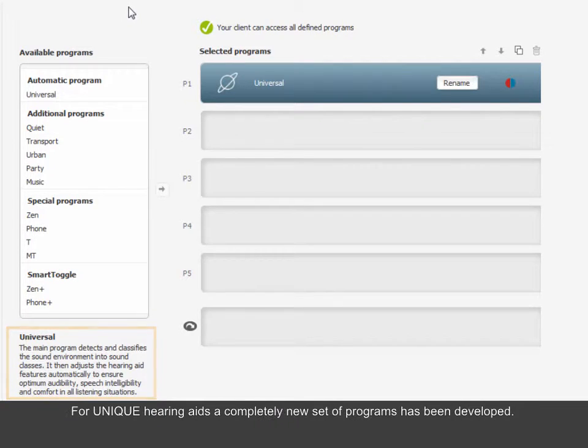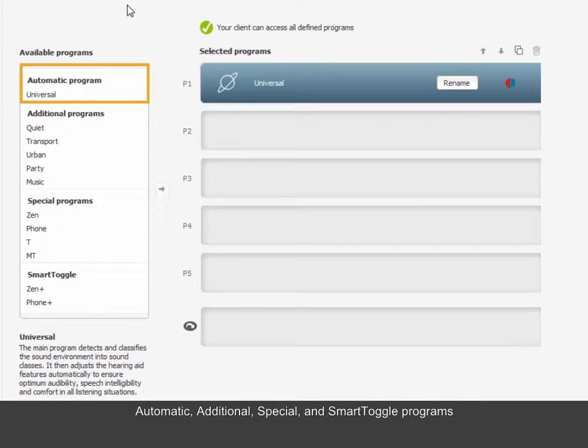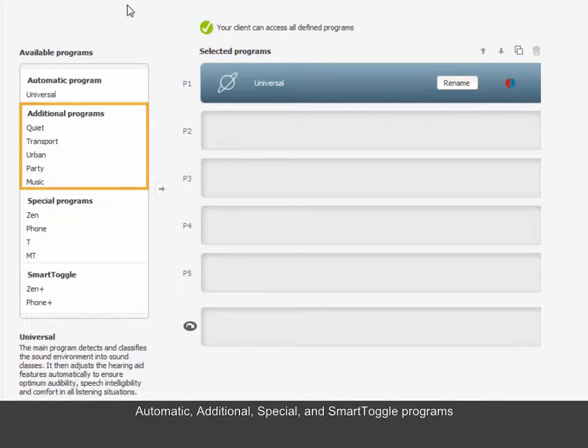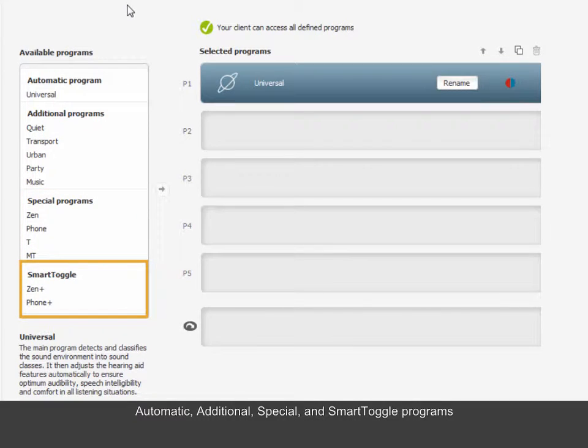For unique hearing aids, a completely new set of programs has been developed. In Compass GPS 2.1, there are four different categories of programs: Automatic, Additional, Special and Smart Toggle programs.